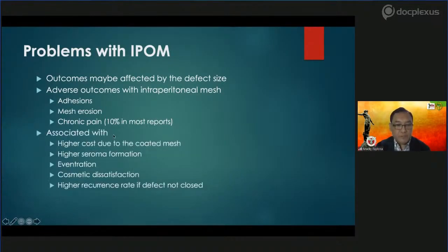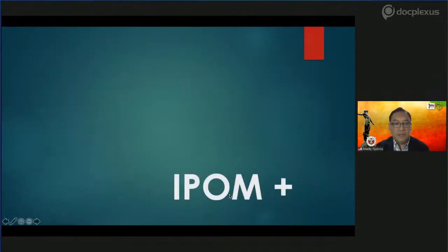It's also associated, of course, with a higher cost due to the coated mesh that you're going to use, and higher seroma formation. Of course, the bigger the hernia, you might have a chance of eventration, and this will bring about cosmetic dissatisfaction to the patient, and there's a higher recurrence if the defect is not closed. And that brought about the IPOM Plus technique.